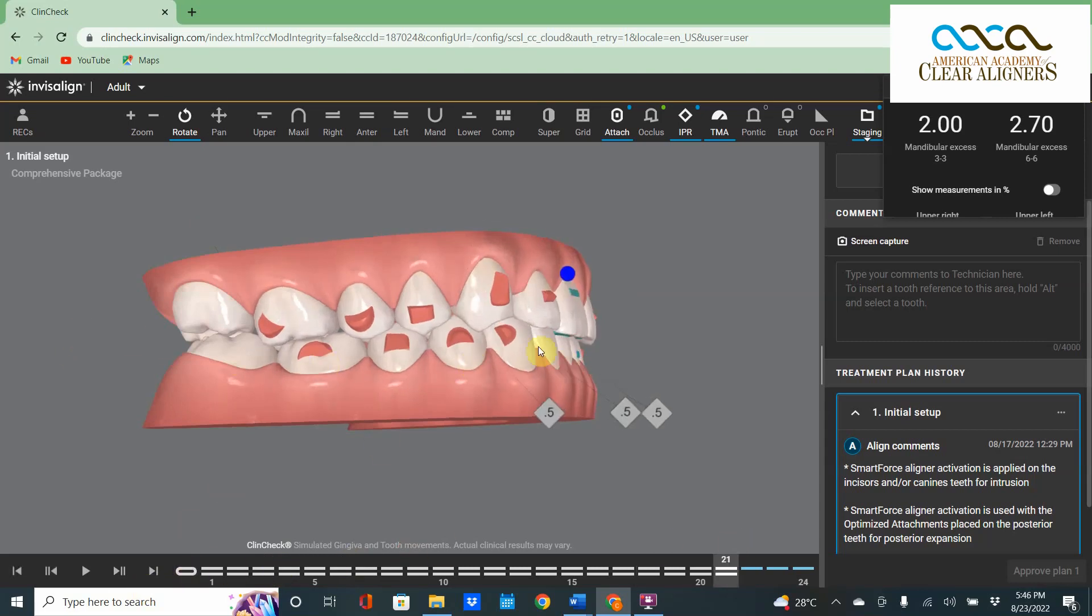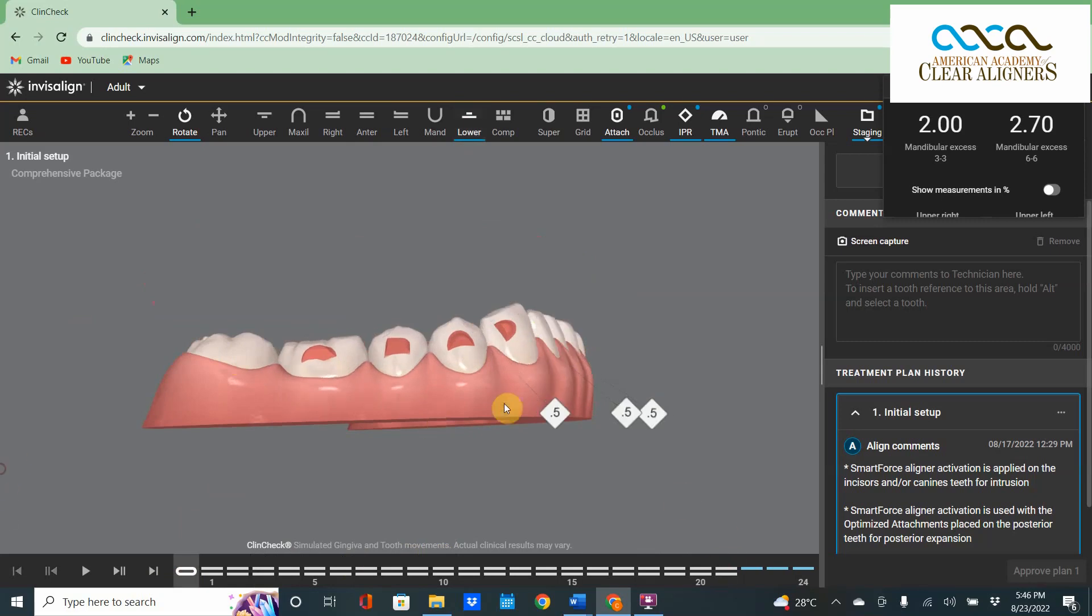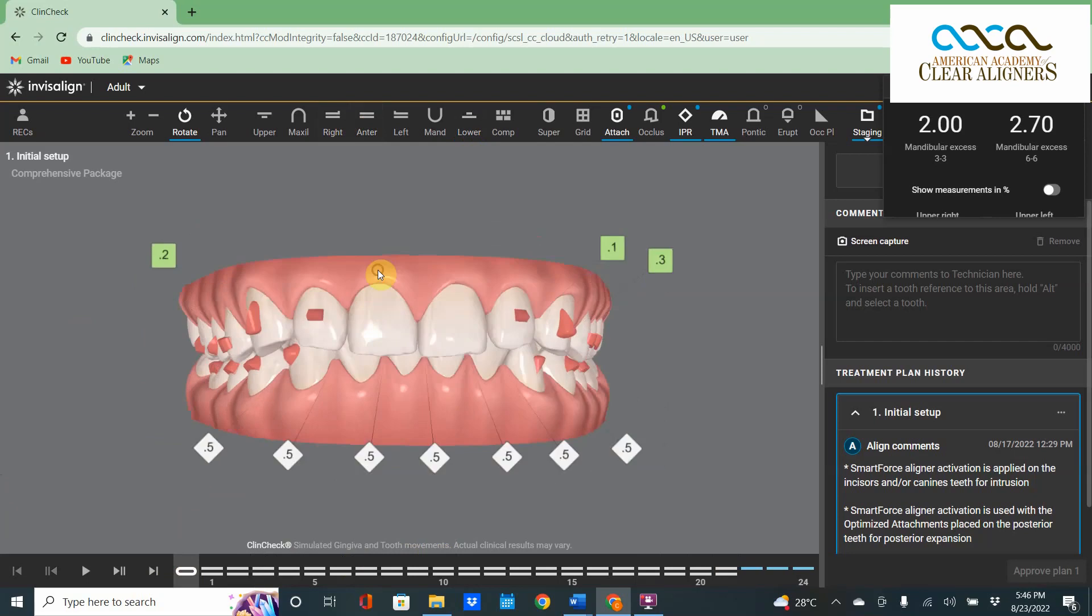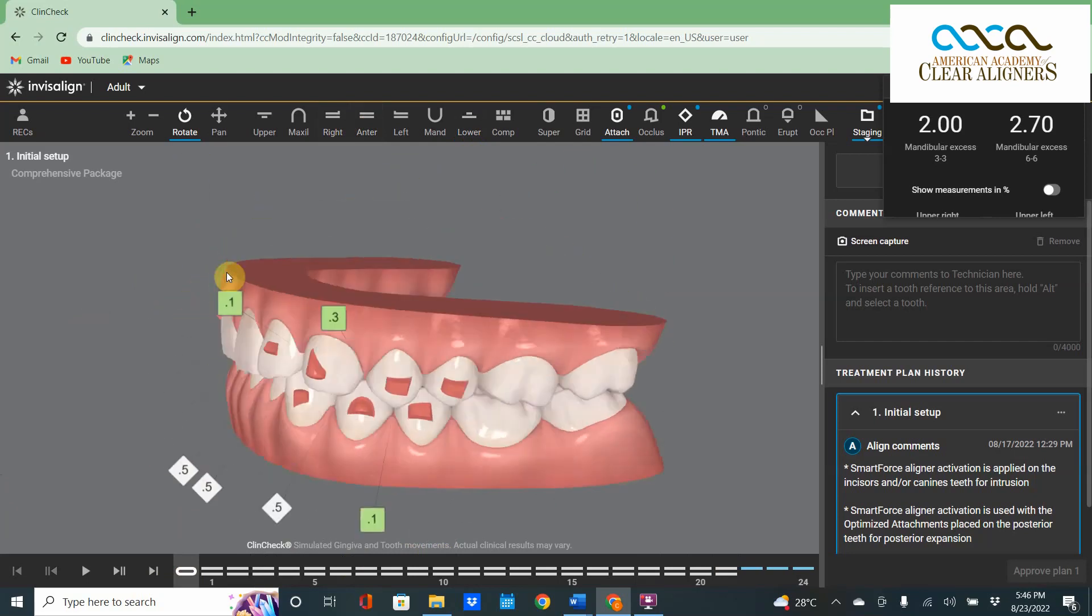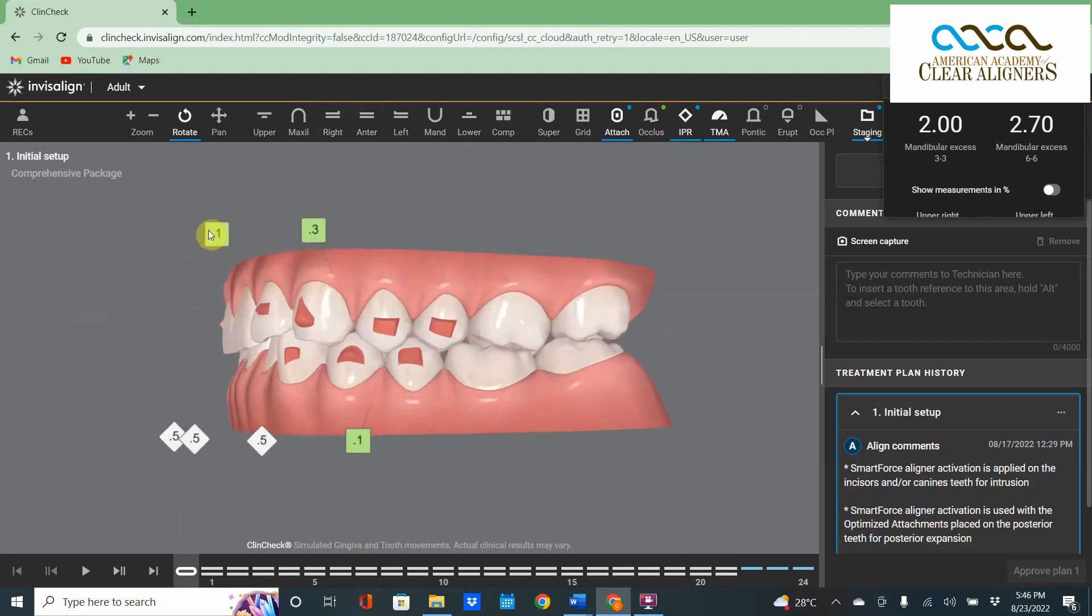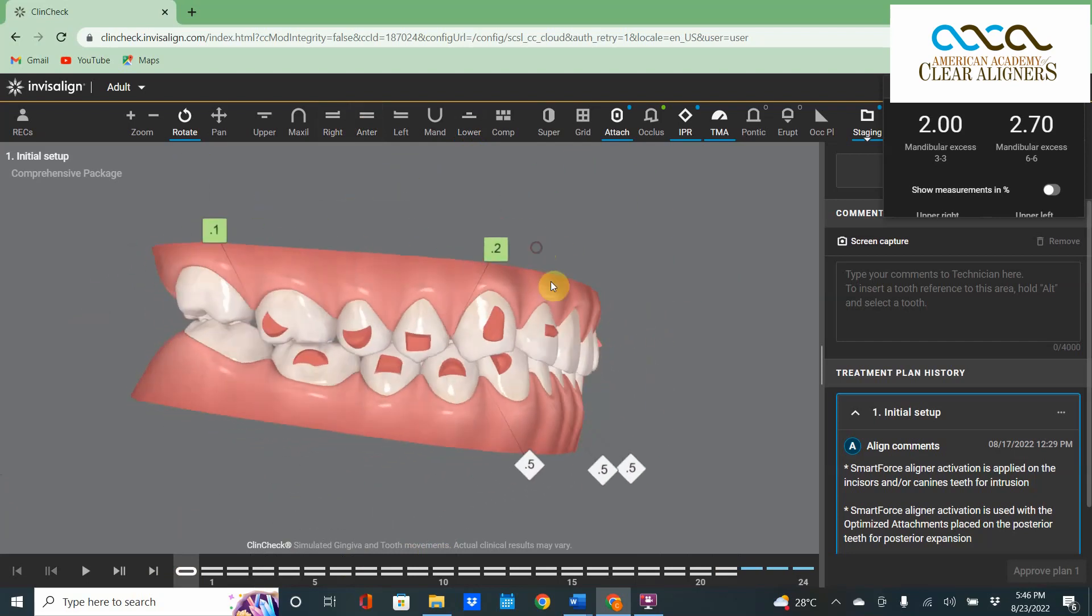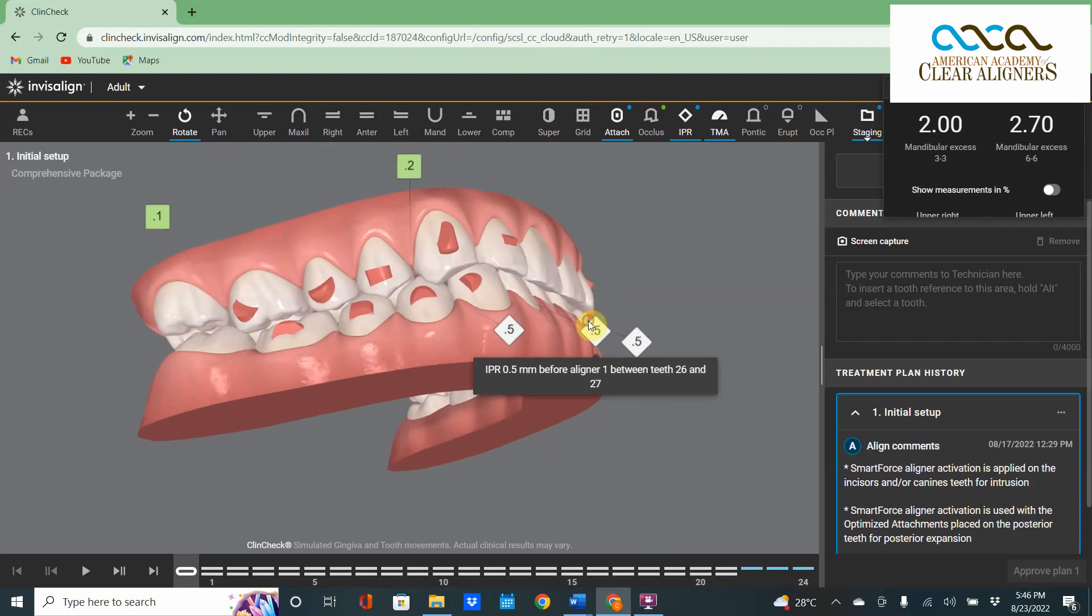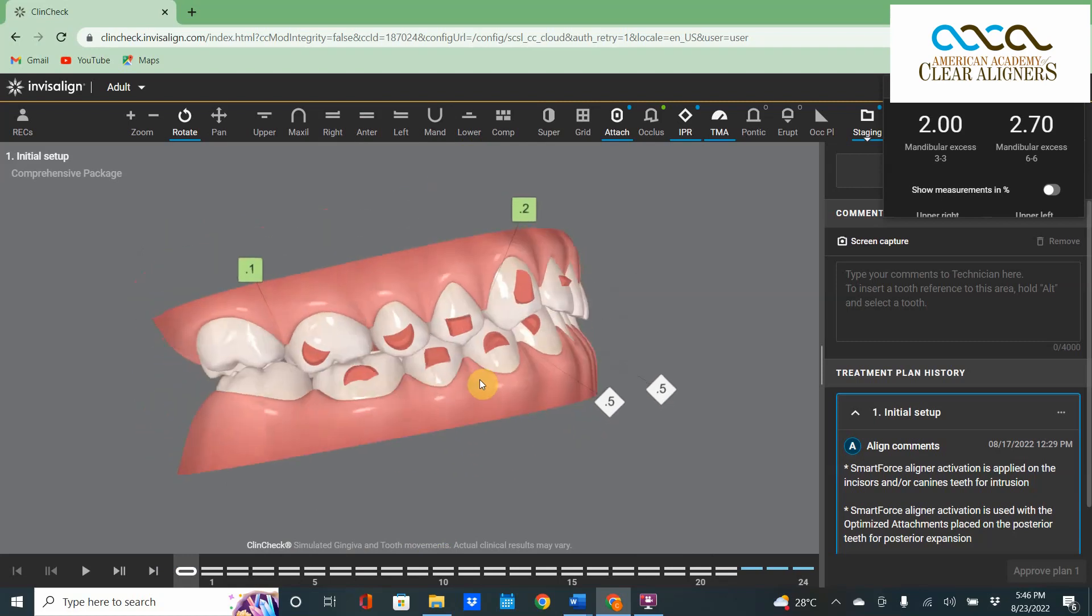Whenever you see lower anterior teeth tip to the lingual with no overjet, that is a major warning sign that we are dealing with a very severe Class III that is trapped. It might look like Class I but it's not.